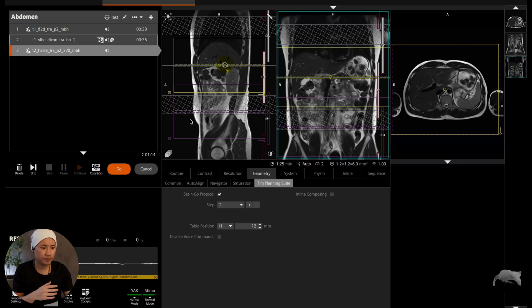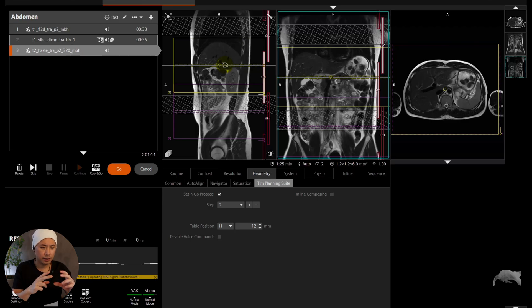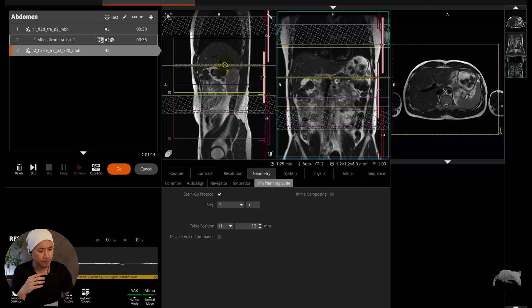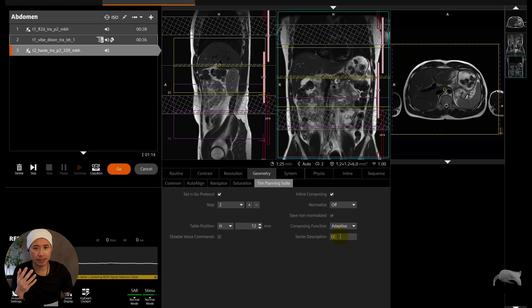As previous, but of course it's a 3D sequence versus a 2D, but however, it's much faster. The field of view is upon each other and so on. And the next part you can do now is just put on the Inline Composing, so you're making sure that your T2 HASTE will also automatically compose itself whenever it's finished.